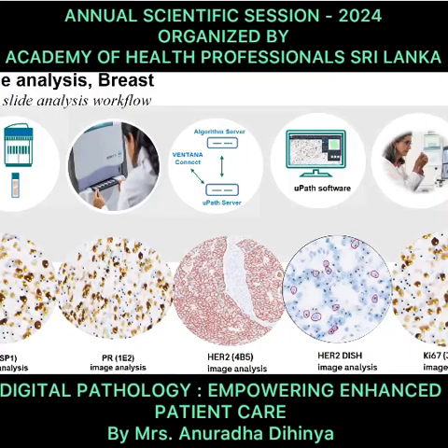Take this into consideration when going ahead with the scanners as well as the algorithm piece. What I would recommend is that whenever a lab is planning to go ahead with digital pathology, many times they go ahead with the algorithm piece at the same time as buying the scanner.